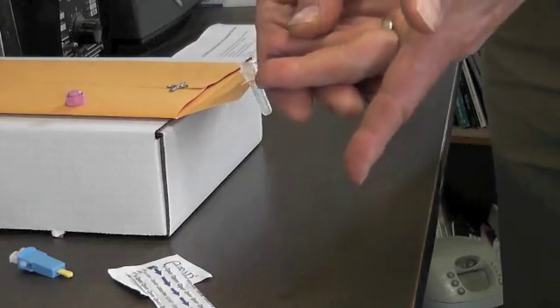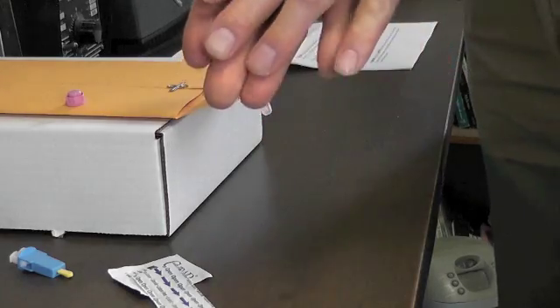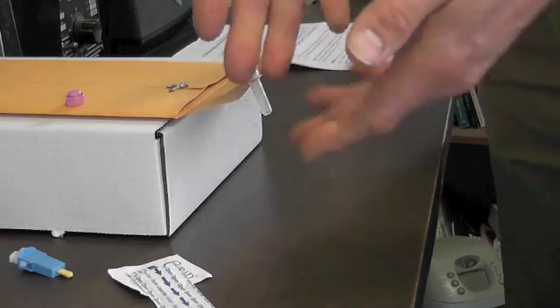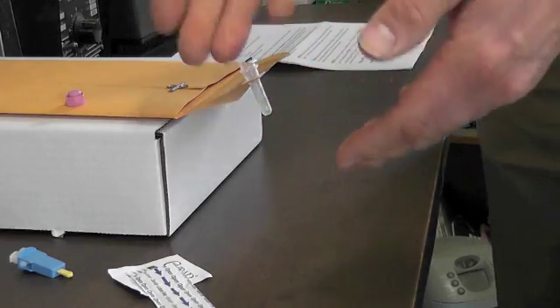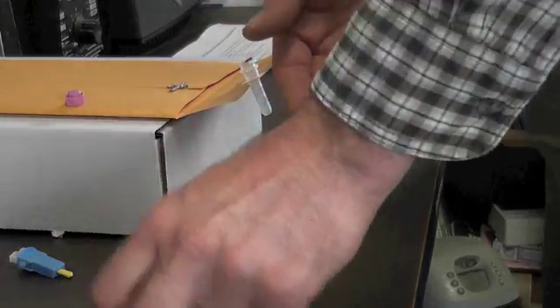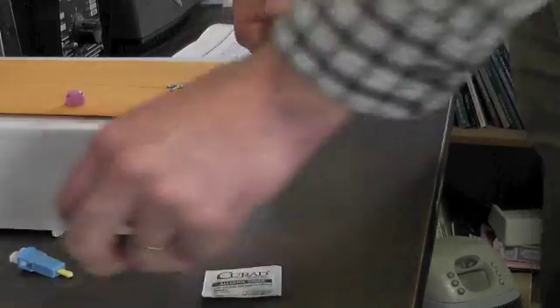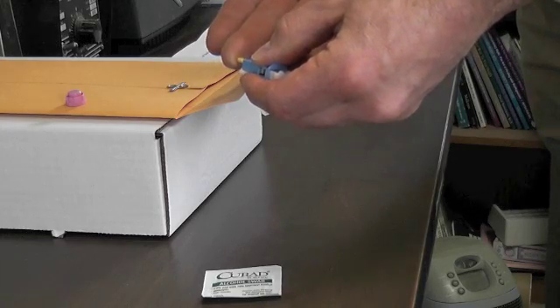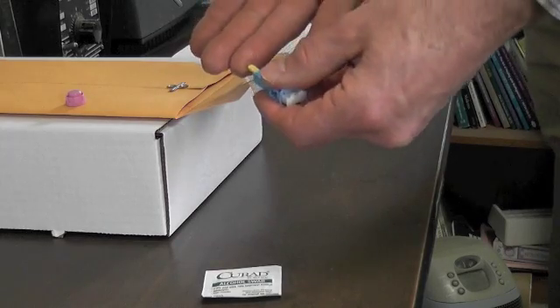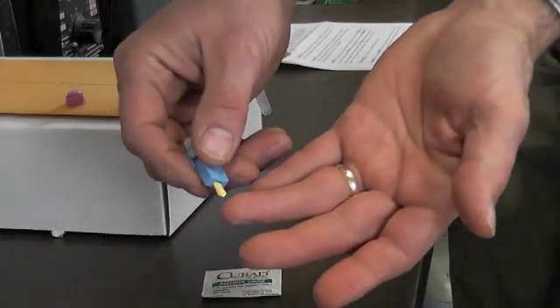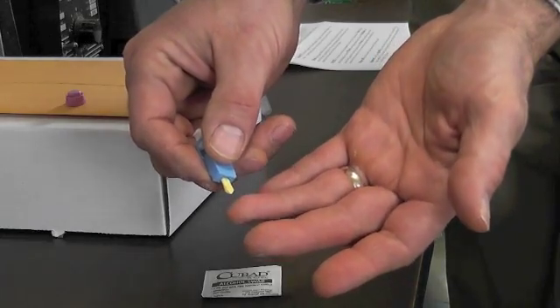Pick a finger. You can use one of the two fingers on the left hand or one of the two fingers on the right hand. I like doing the right hand first. If I run out of fingers, I'm going to do the other one. But in this case, you're doing just one finger. You want to pick a side that's away from your thumb, like right here on this finger. That works really well.